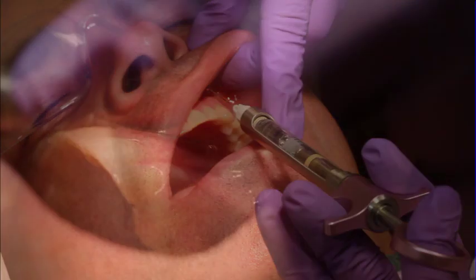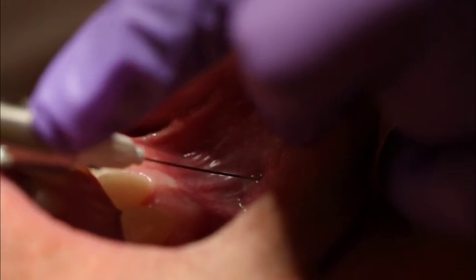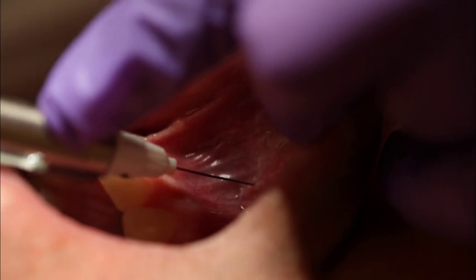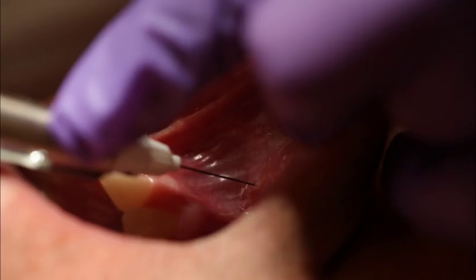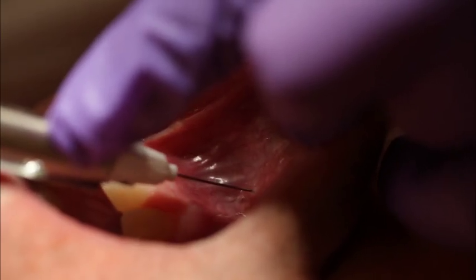Insert the needle at the height or depth of the mucobuccal fold, parallel to the long axis of the tooth, and insert the needle approximately 1/4 of the depth of the short needle, approximately 5 millimeters, or until the bevel is slightly superior to the apex of the tooth. You should feel no resistance or bony contact.